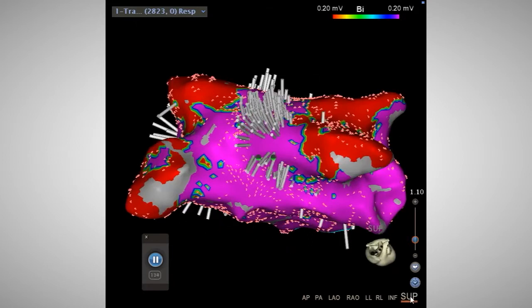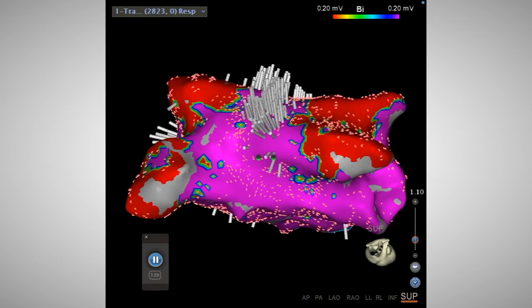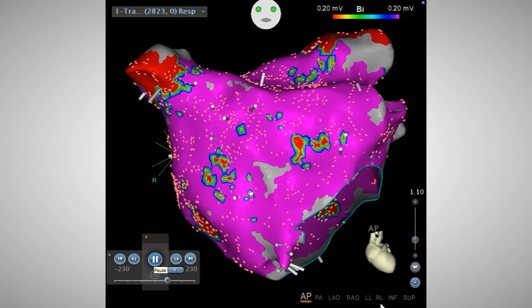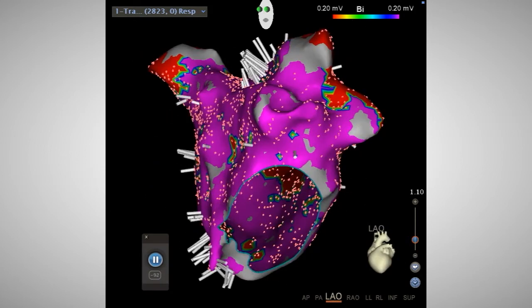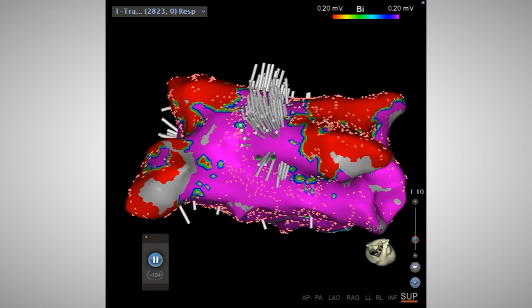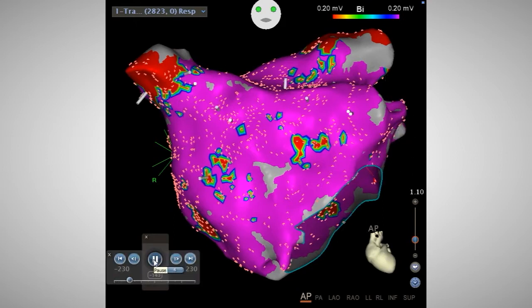Now we can see clearly a wavefront moving across the atrium, demonstrating a left atrial roof-dependent mechanism. We can see progressive propagation through this tachycardia from low to high across the septum towards the left atrial appendage, and we can see it coming over the roof towards the anterior left atrium as well. With this, there was no window of interest set and no annotation of any points. These were the real data points, in essence, displayed dynamically.